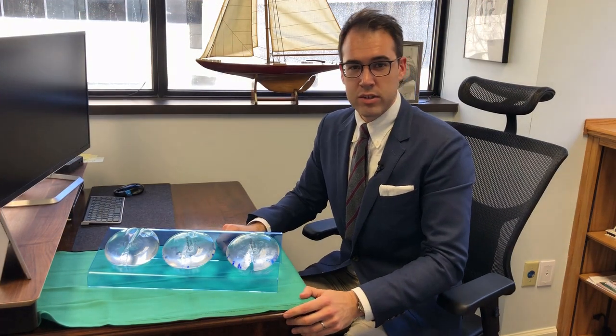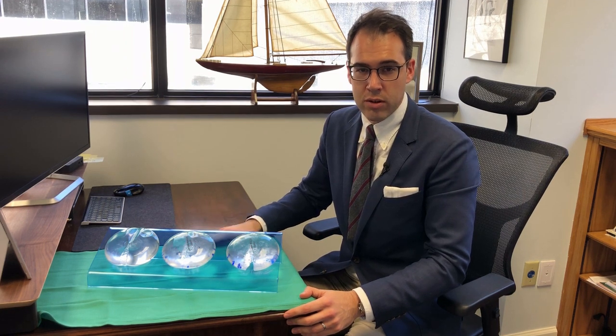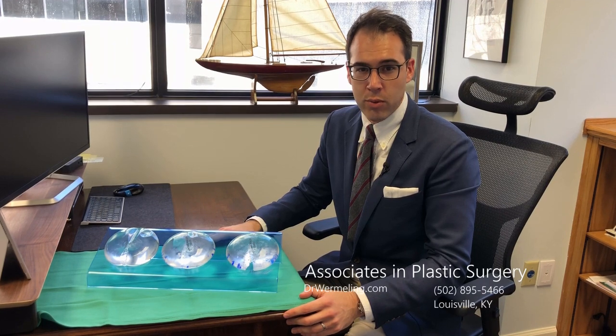So that's a brief introduction to the implants we use here at Associates in Plastic Surgery. If you have any more questions about implants used for reconstruction or interested in learning more about an augmentation or a breast lift, feel free to get in touch with the office.